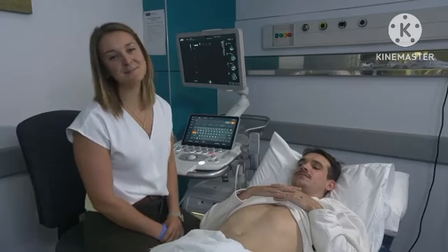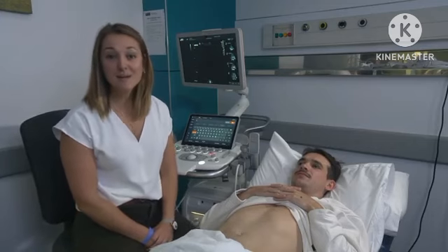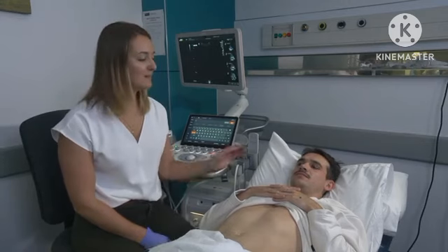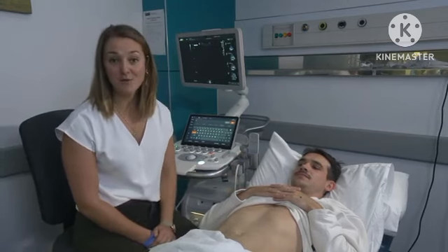Hi everyone, my name's Adriana and I'm one of the sonographers at the University of Auckland. Today we're going to be learning about how to scan the gallbladder. We have our lovely volunteer Bruce who is going to be acting as a model for us to scan.